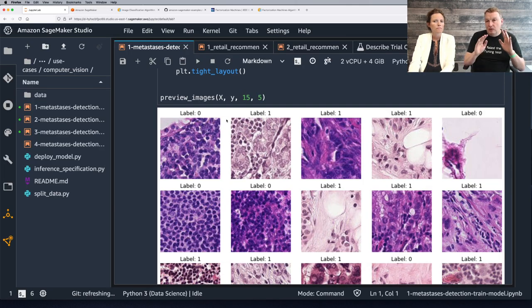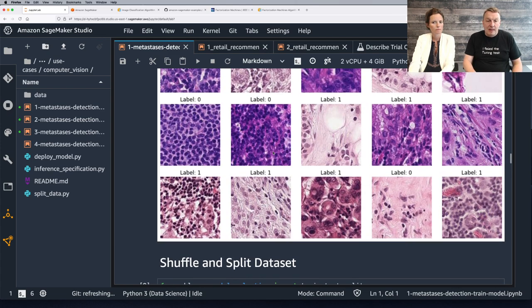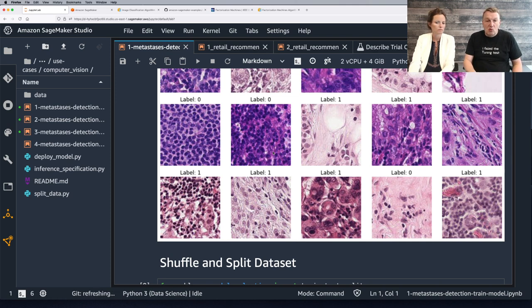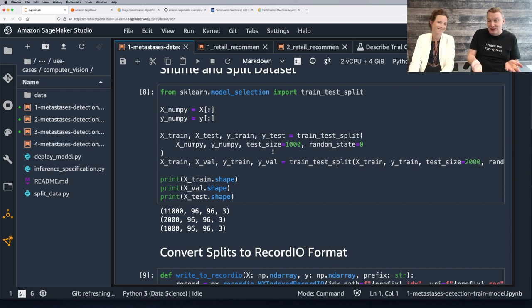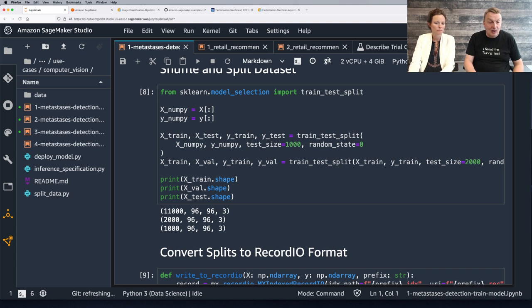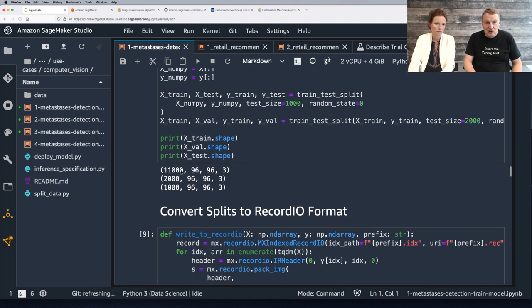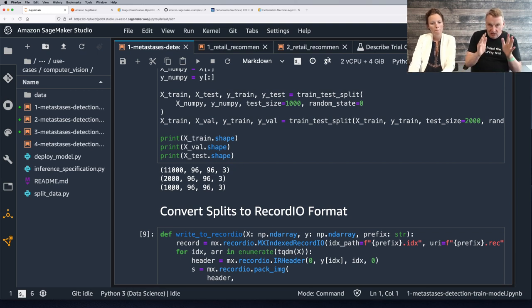We have the labeled images, so we don't need to do that here. What we probably need to do is split for training and validation. We do that pretty easily using this API. We have 11,000 images for training, 2,000 for validation, and we keep a test set of 1,000 for benchmarking. So now we have those three datasets.